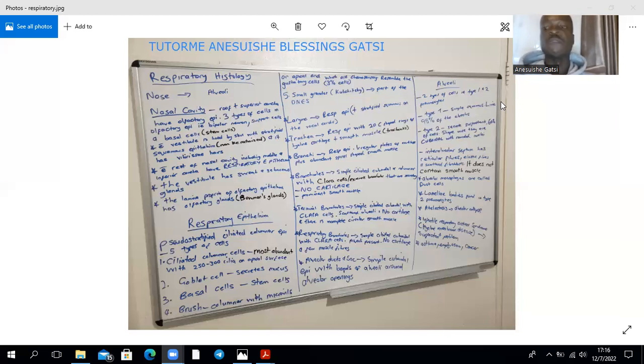Right. Then the alveolar macrophages are a bit unusual in the sense that they're not only in the connective tissue, like I said, you can also find them within the alveoli. So they're also going to bulge within the lumen of the respiratory system, which is the same thing that you expect to find with the Clara cells. They also bulge into the lumen of the bronchioles, right? And clinically, you can talk about infantile respiratory distress syndrome, also known as hyaline membrane disease.